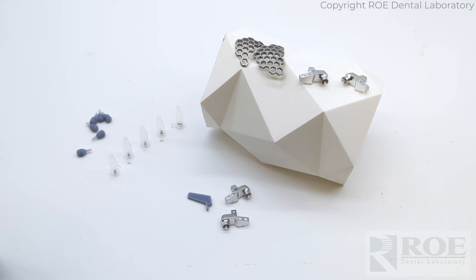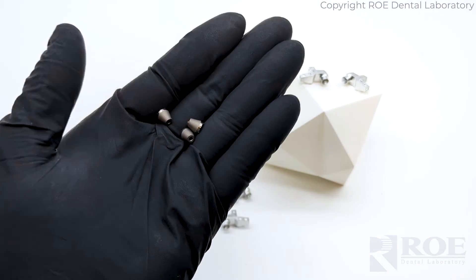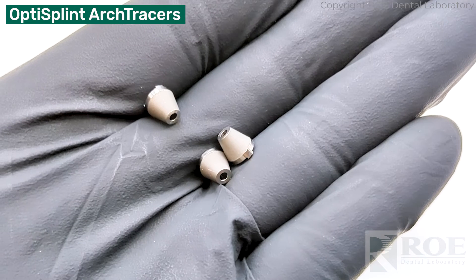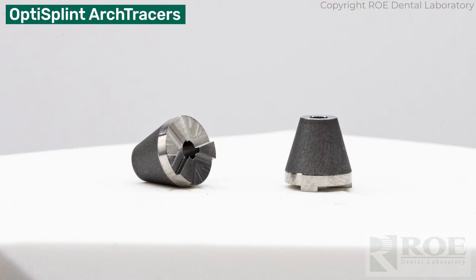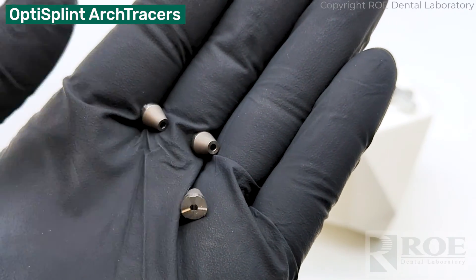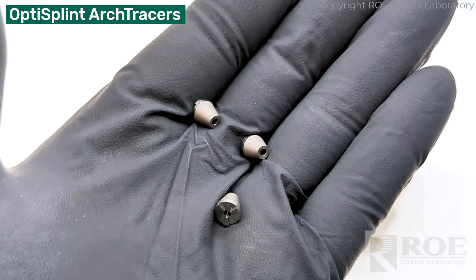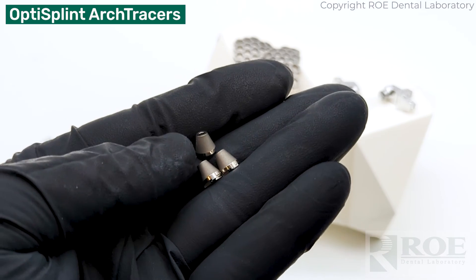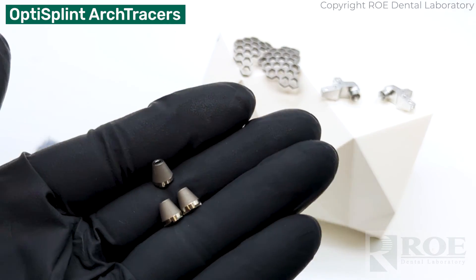Lastly, another item sold outside of the kit is called arch tracers. In these surgeries, doctors use screws, TADs, and other small devices that are hard to identify, scan, and register because of their size. These large arch tracers are generally screwed into the labial during surgery and are very easy to scan with an iOS scanner. They are reusable, as opposed to the OptiSplint.